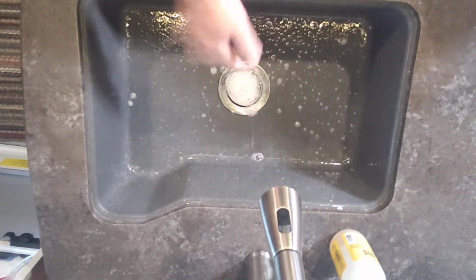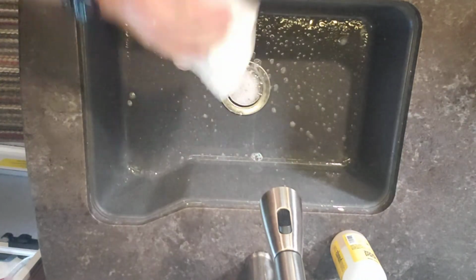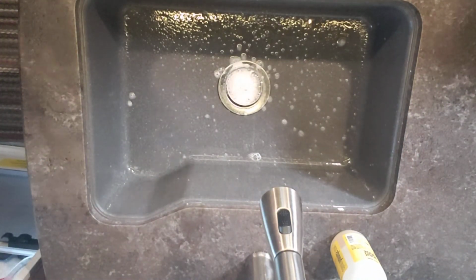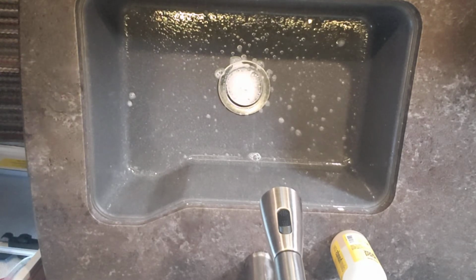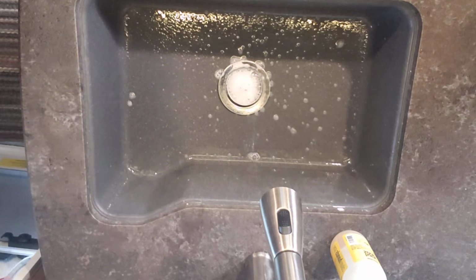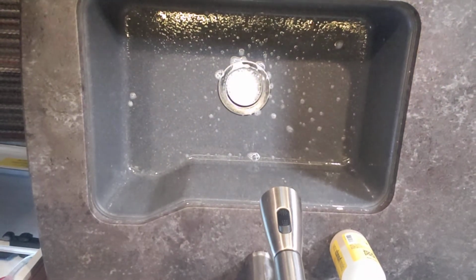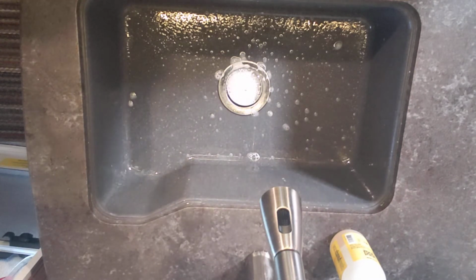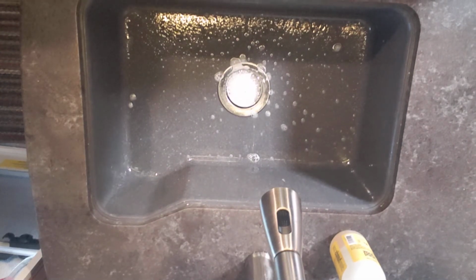Here's a paper towel. You can use a cloth to dry your hands as well if you don't have paper towels. You just make sure you use a clean cloth. All right, makes sense. Okay, great. Any questions? Nope, no questions. Okay, let's move on over to the table and we'll simulate oxygen placement on your baby.